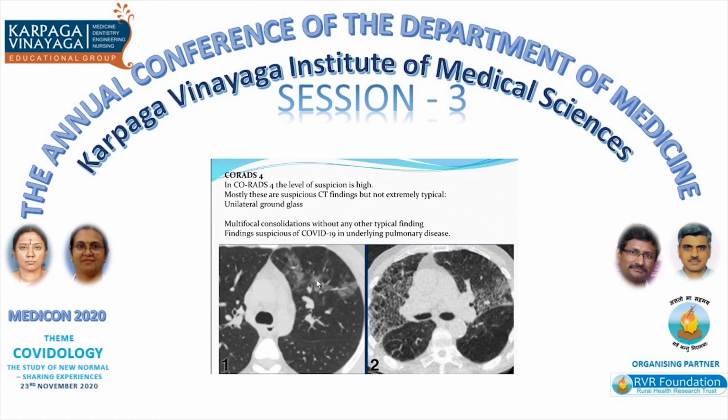So nobody could give a guarantee whether they are 100% not COVID, and the anesthetists were really afraid to intubate and do the surgery. If the surgery is not very critical, then they can wait for 2 weeks. Then we repeat the RT-PCR, see the symptomatology, and repeat the scan. If it is COP, with the patient on steroids, this disappears. And if it is something like NSIP, it won't disappear. So this is how we can triage the patient based on the CT findings.